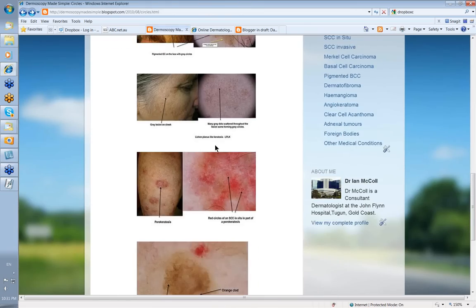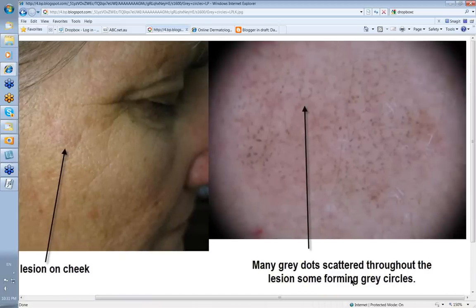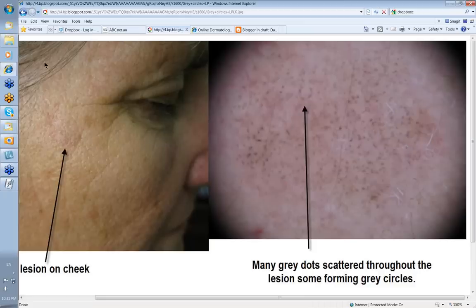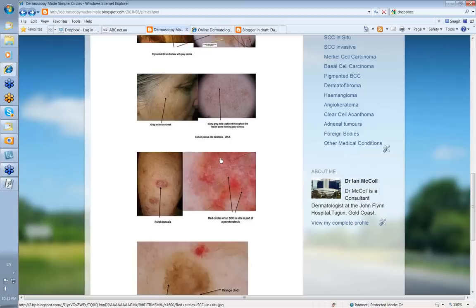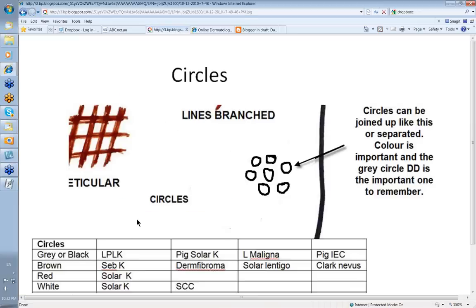This is a grey lesion on the cheek. When you look at it with the dermatoscope, you can see very definite grey circles, but there are a lot of grey dots here as well. They seem to be distributed around the openings of hair follicles on the face. When you have coarser dots like this, it's much more likely to be a lichen planus-like keratosis — a lichenoid reaction causing melanin to be in the dermal melanophages. This is the more typical picture of lichen planus-like keratosis as against lentigo maligna or pigmented IEC. So those are the grey or black circles: lichen planus-like keratosis, pigmented solar keratosis, pigmented IEC, and lentigo maligna.